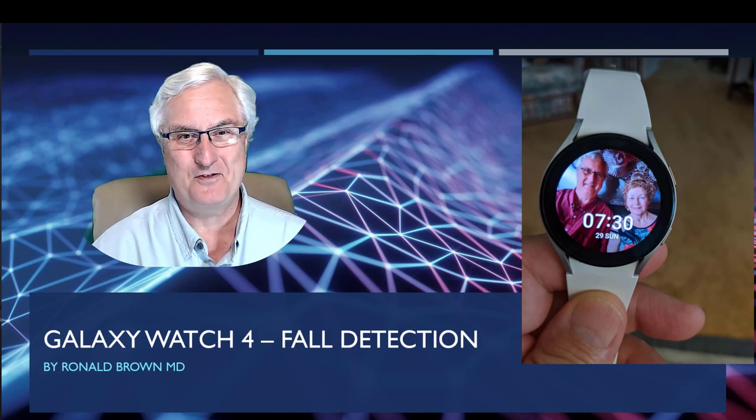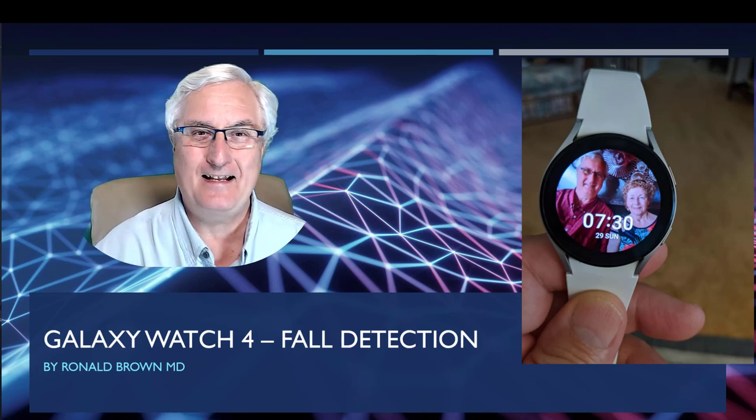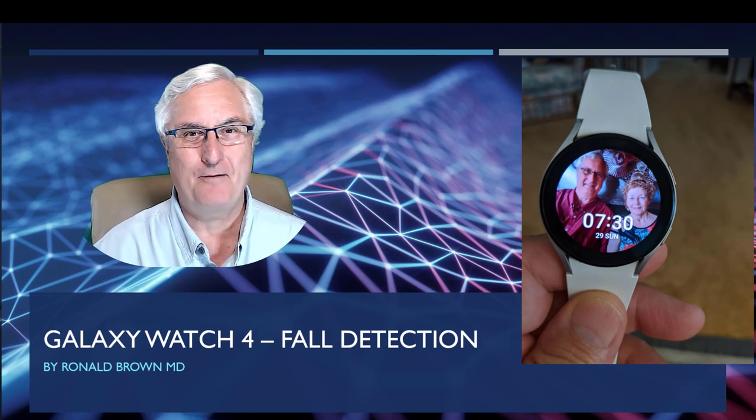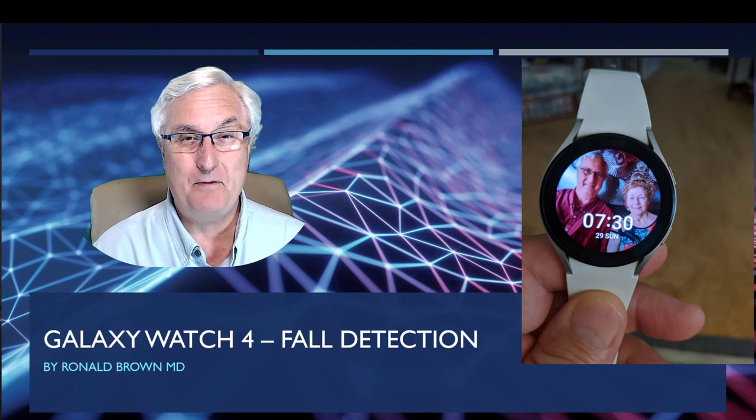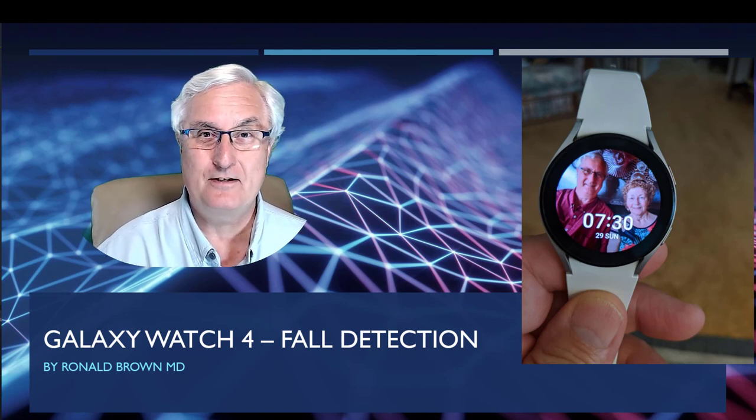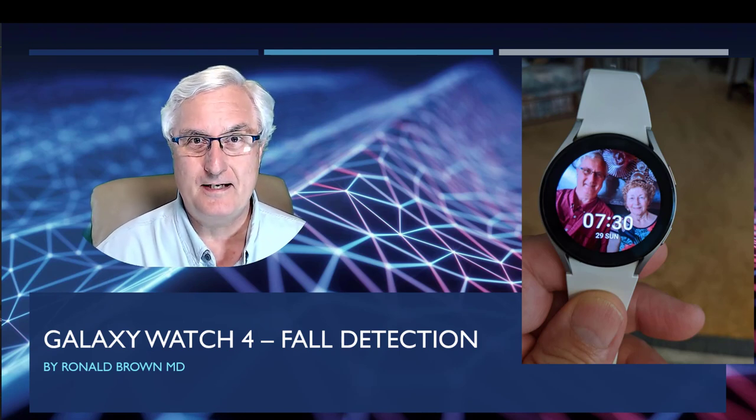It's Ron Brown with Tech for Seniors. The Galaxy Watch 4 is out! I got mine last Friday, four days ago, and I'm putting it through the paces. Today we're going to talk about fall detection.